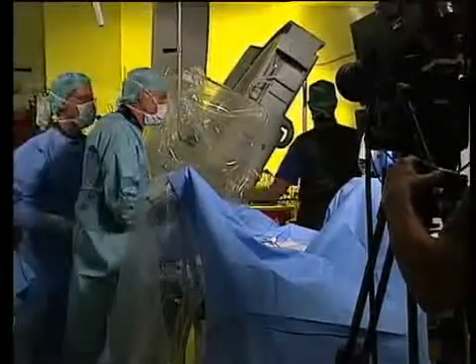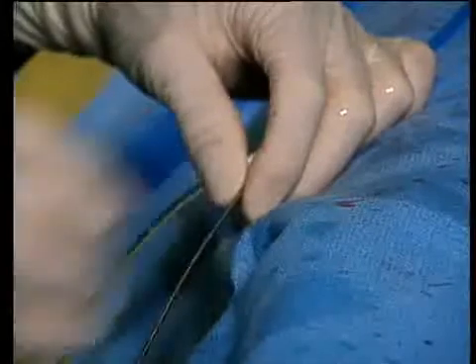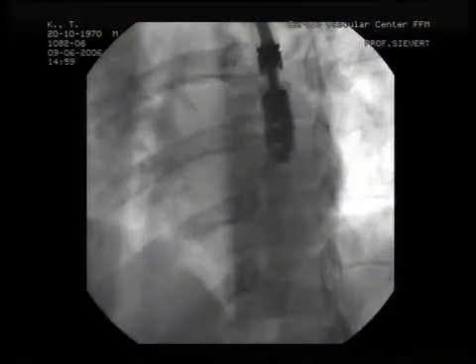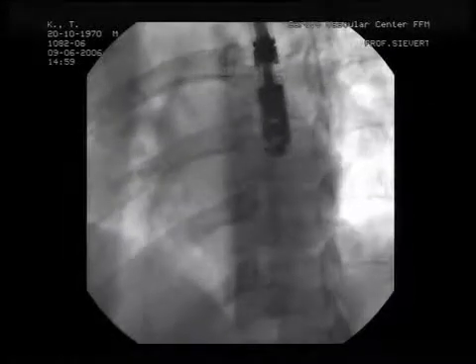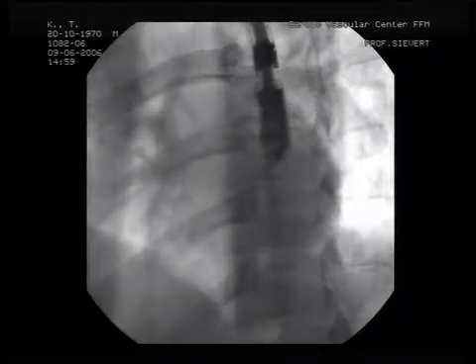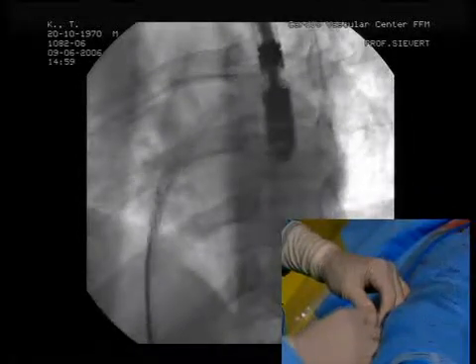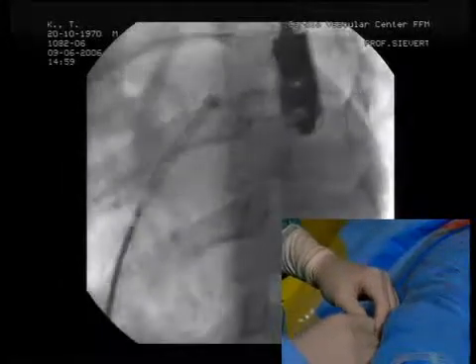I assume the deployment technique is quite similar to the Amplatzer technique, right? Of course, as you can see, it's very similar to the Amplatzer technique. How many cases have you done so far? That's the fourth case, because we just started the clinical trial. And here you see the visibility is — you can see it here.